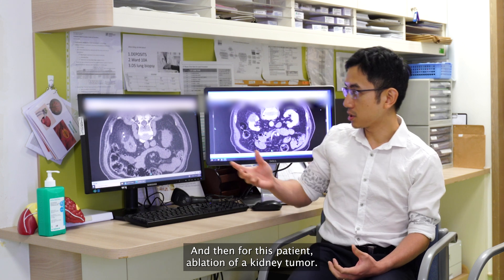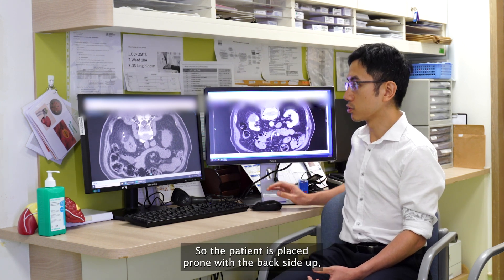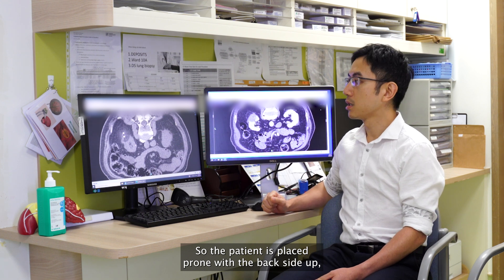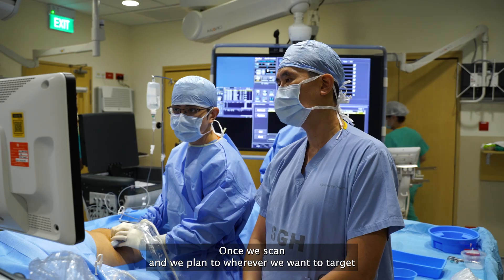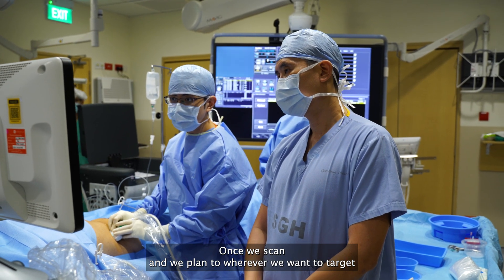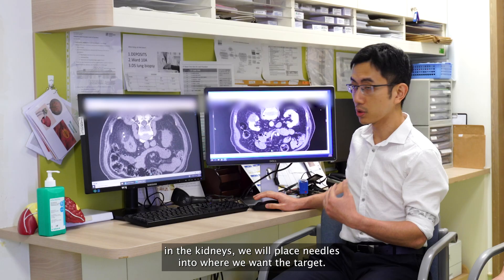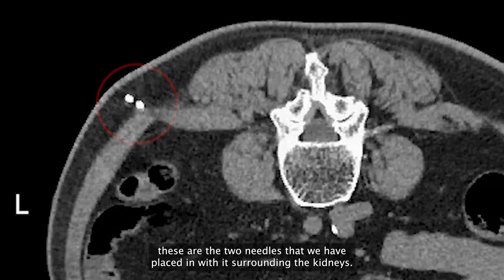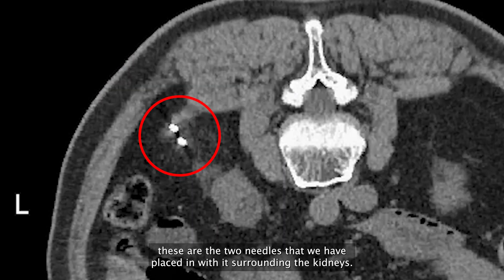For this patient, the patient needs ablation of a kidney tumor. The patient is placed prone with the back side up, as the kidneys are closer to the back of the body. Once we scan and plan where we want to target in the kidneys, we will place needles into where we want to target. And in this case, you can see this bright structure over here — these are the two needles that we have placed surrounding the kidney.